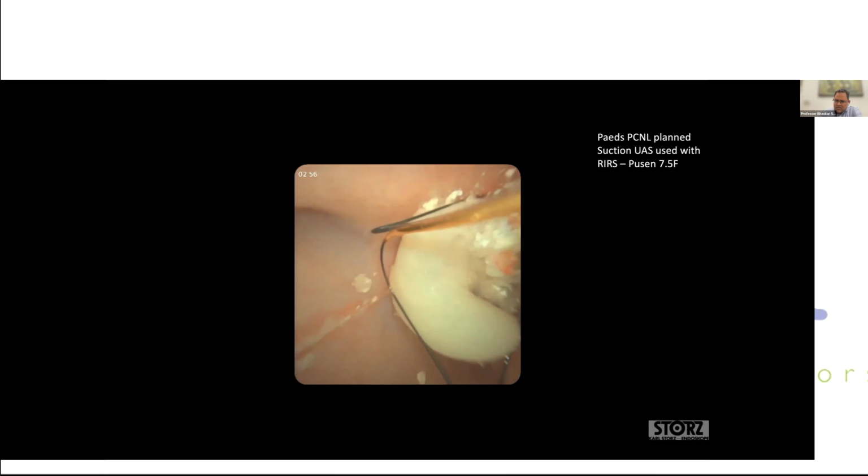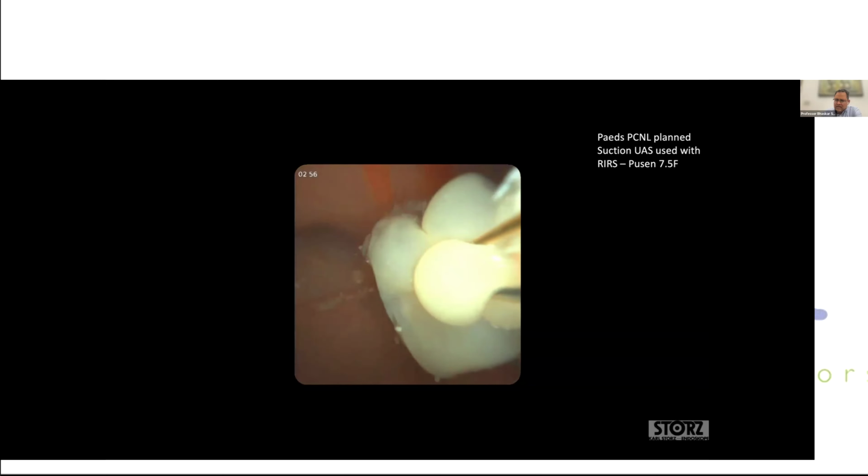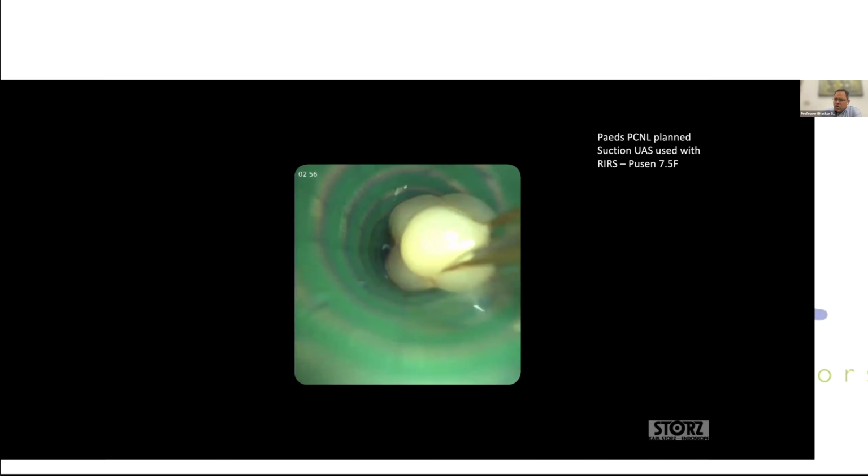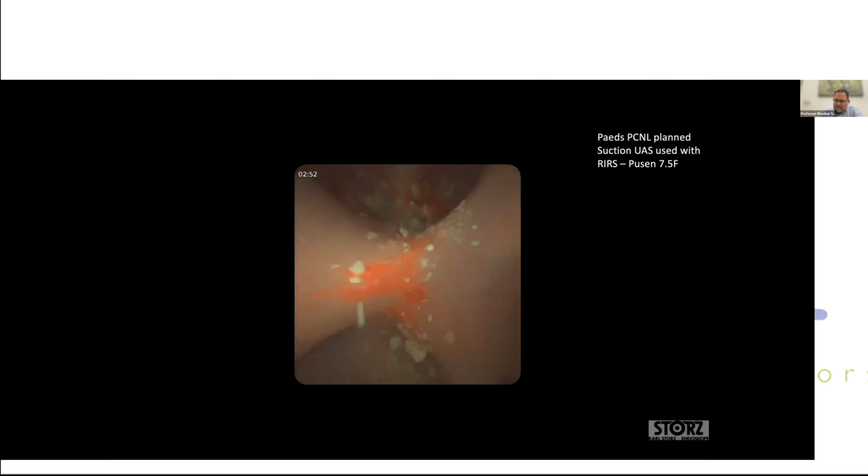Here you can see this is one of the last bits, almost like a mucus material. I'm sucking out and then it's completely clear. So I think this offers a very good way of clearing out stones, big stones. And there we are. This is the end view. Just a little bit of dust, in a dilated kidney, planned for PCNL, and we did ureteroscopy.